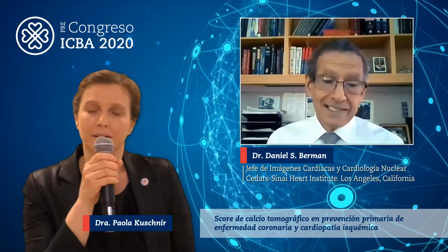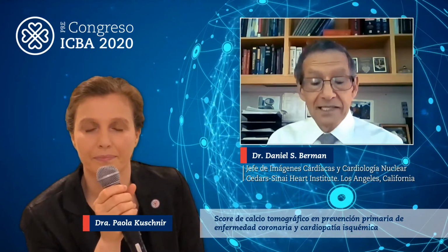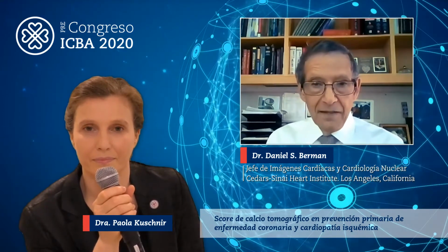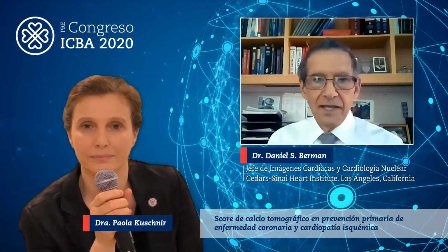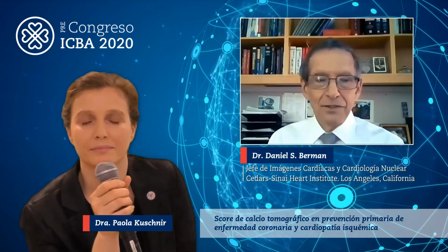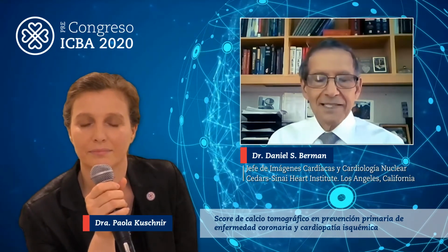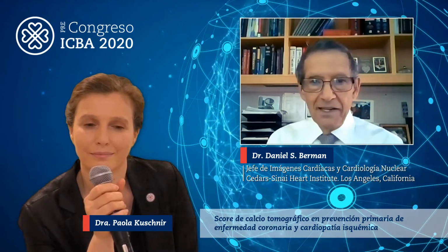The recommendations are that it be at least a 16 slice scanner with a rotation speed of at least 500 milliseconds. But to do that well, the heart rate really should be quite well controlled. A 64 slice scanner, the more modern scanners, have adequate temporal resolution to be able to do this. So it becomes a study that's not technically challenging. It's very easy to do.